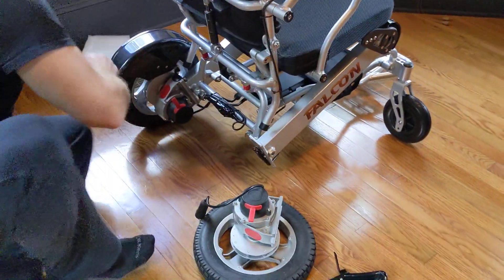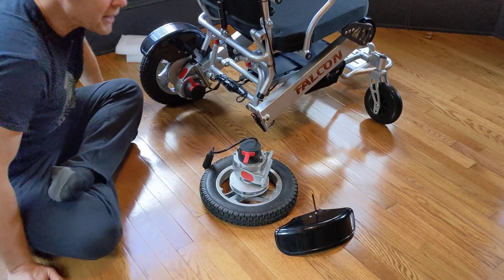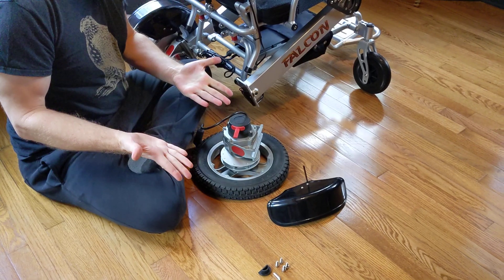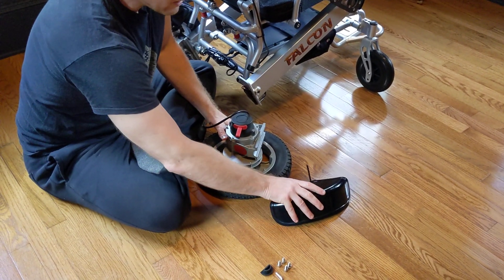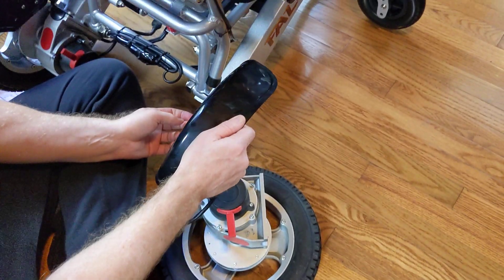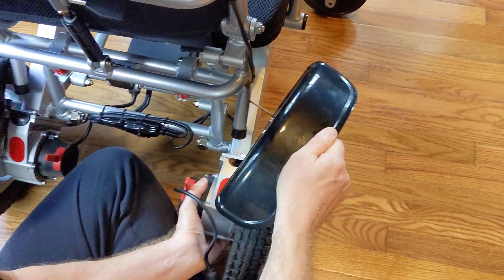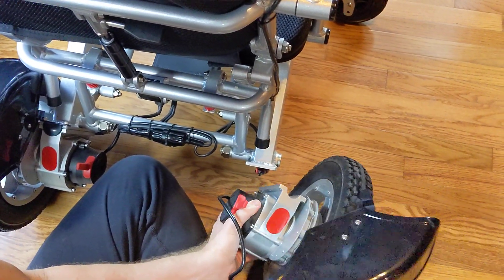This is something that some people can do by themselves and something others might need assistance with. I can still get down and sit, so I'm just going to do it myself. The fender is going to sit basically right on top and the actual motor sits on the bottom, so we're going to sandwich the frame in between the two.